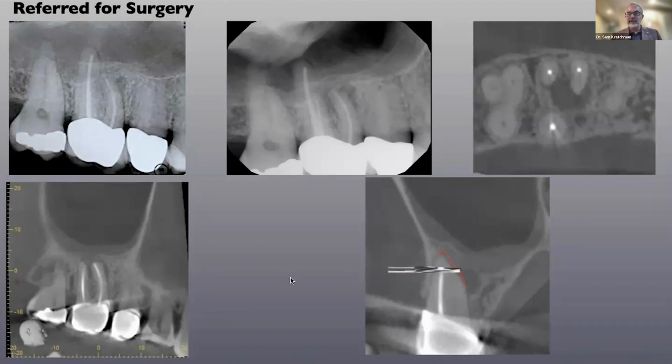If I was going to do a surgery, here I'm cutting off, this is my Lindemann burr that I use for apical surgery, cutting off the tip of this root. I teach all my residents to cut off 3 millimeters of root, but then I'm barely addressing the MB2. Then I have to dip down like that to get to the MB2, level it off. Now I'm sacrificing the crown root ratio. So definitely you have to do a conservative retreatment here.